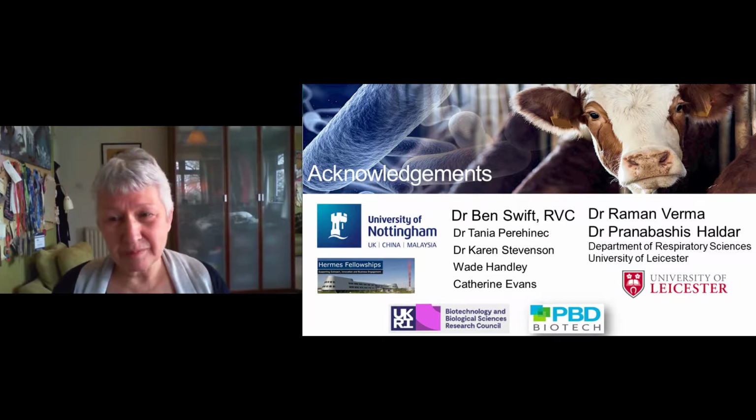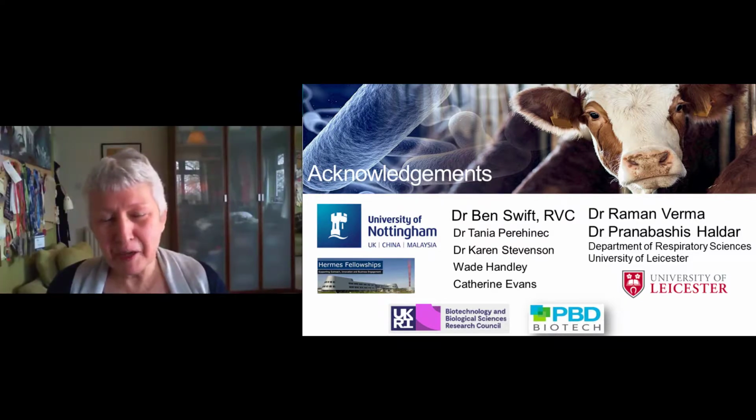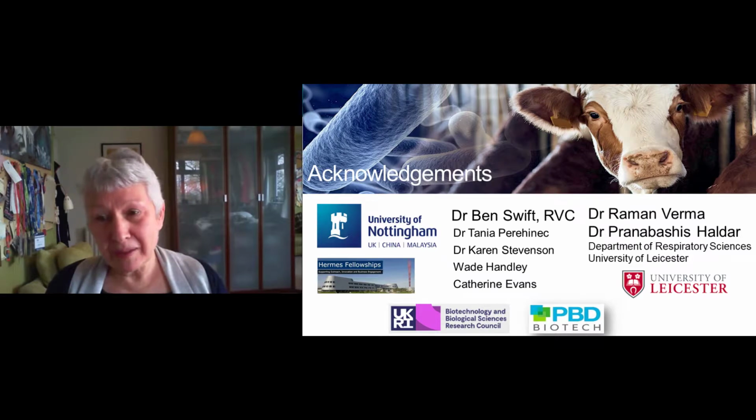Another question then is, can your test distinguish between live and dead TB? Yeah, absolutely. And this is the point I was trying to make: we have to have those mycobacteria alive and get them into some media to get them metabolizing, otherwise the phage won't infect. Now, like many viruses, these viruses have a recognition system, whereby they detect the metabolic state of the cell as they bind to the surface. There is a change in cell-phage interaction depending on the charge state of the membrane. So if the cells are not viable, the phage don't infect, they can't replicate, they can't break the cell open, so we don't get any positive results with dead cells.